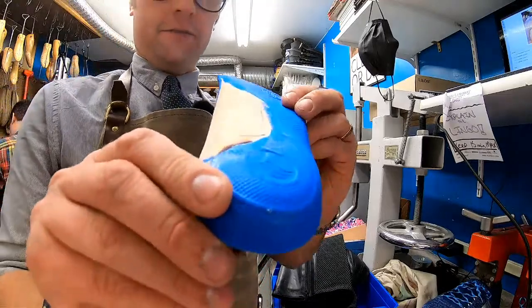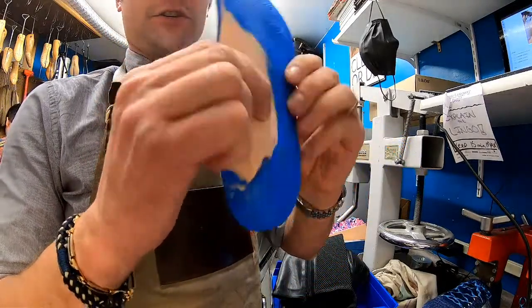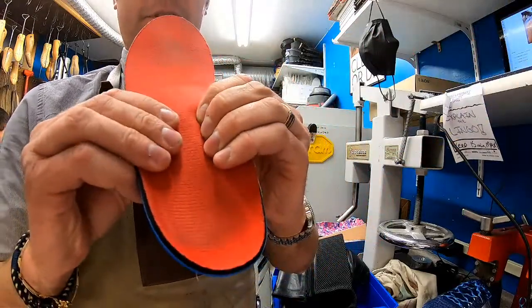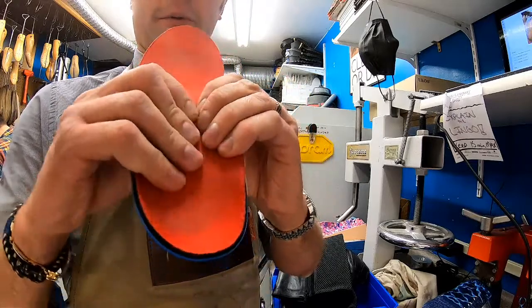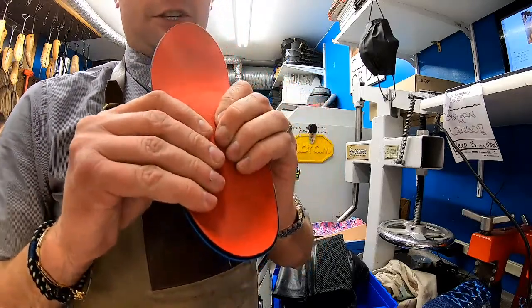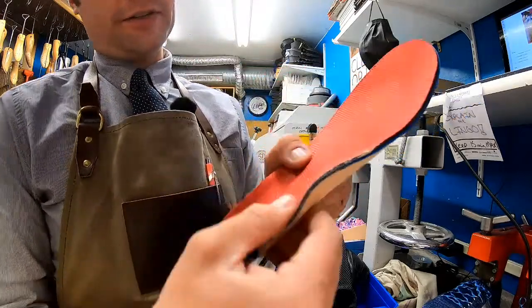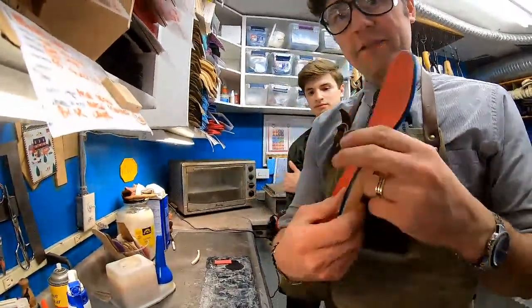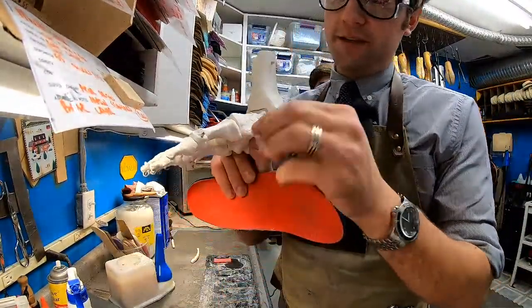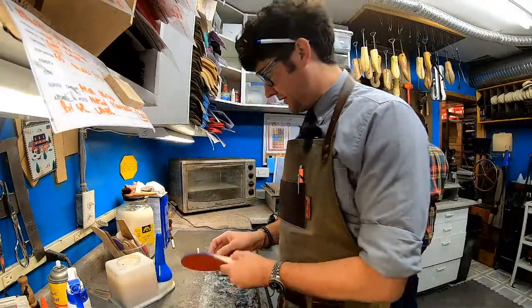What we have here is a much more squared off medial arch, and the one thing we just want to make sure we don't do is, we have this defined line right here where we remove that plastic. It should be fine. The body weight's going to compress this area. We have a combination of materials, and you can see it a little bit right there. The sensitivity is really right on the navicular, or the side of the foot. So this should reduce a lot of that pressure.